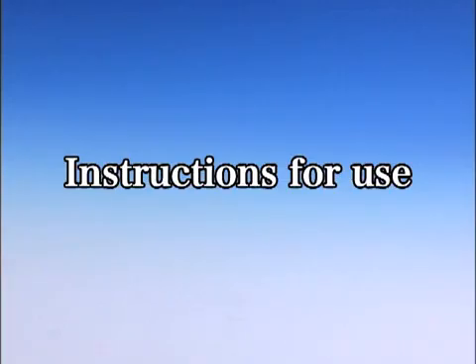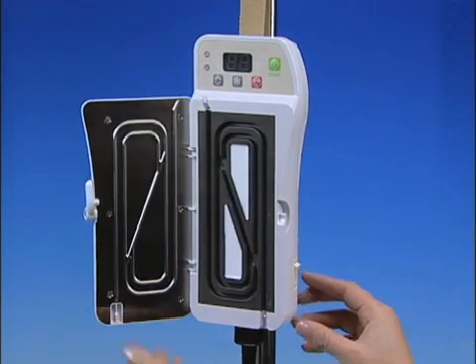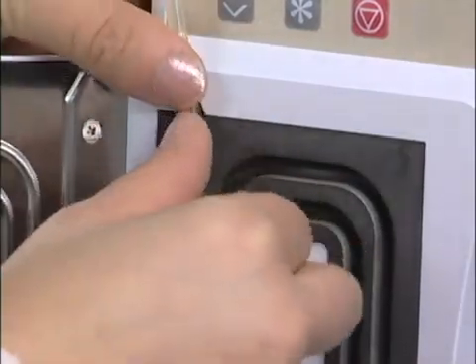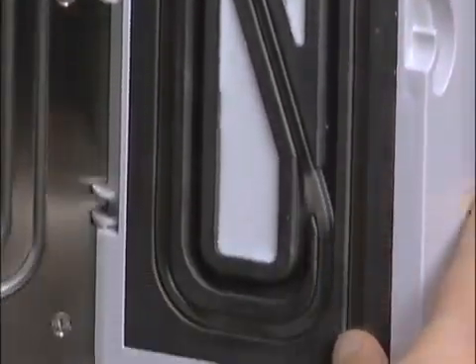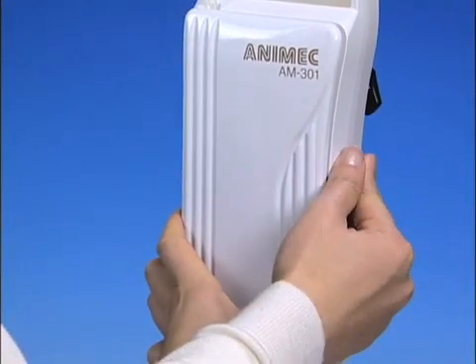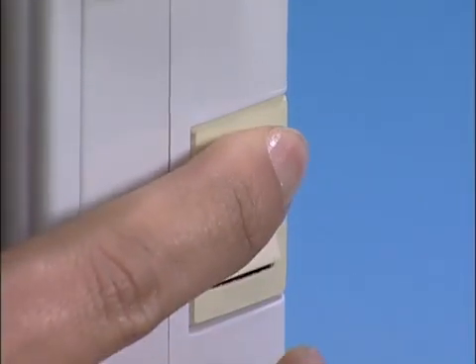Instructions for use. Allow me to explain how to operate the device. First of all, open the cover. Set a transfusion or infusion tube into the channel and connect. And close the cover.